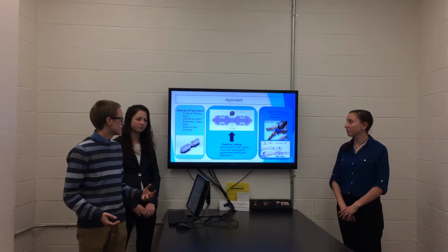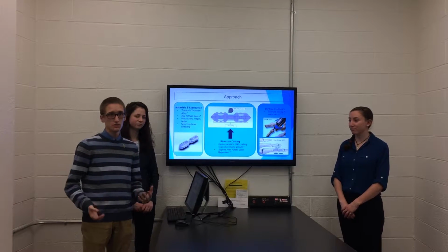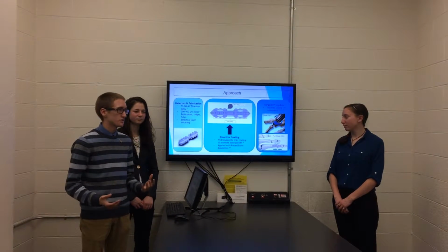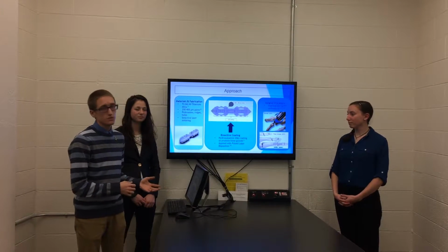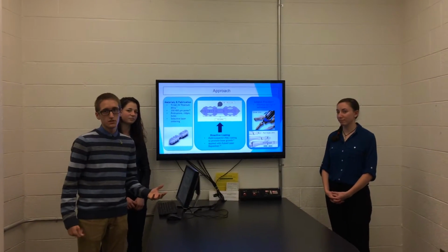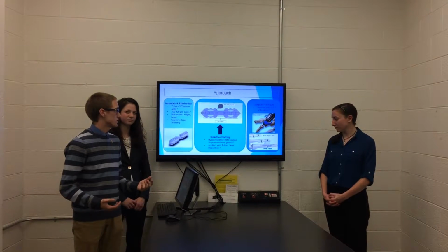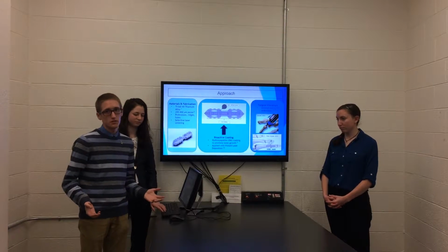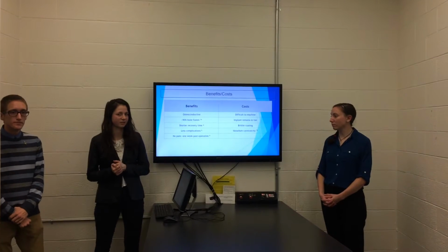Once the device is fabricated, we're going to include a hydroxyapatite coating applied using pulse laser deposition, and the hydroxyapatite is going to further increase the osteocyte activity as well as osteoblast adhesion. Finally, the implant is going to be inserted using the same surgical procedure, the PIP arthrodesis, which is used by surgeons to insert the K-wires. In this case, it's going to be a familiar procedure to the surgeons and is not going to require any changes on their part.